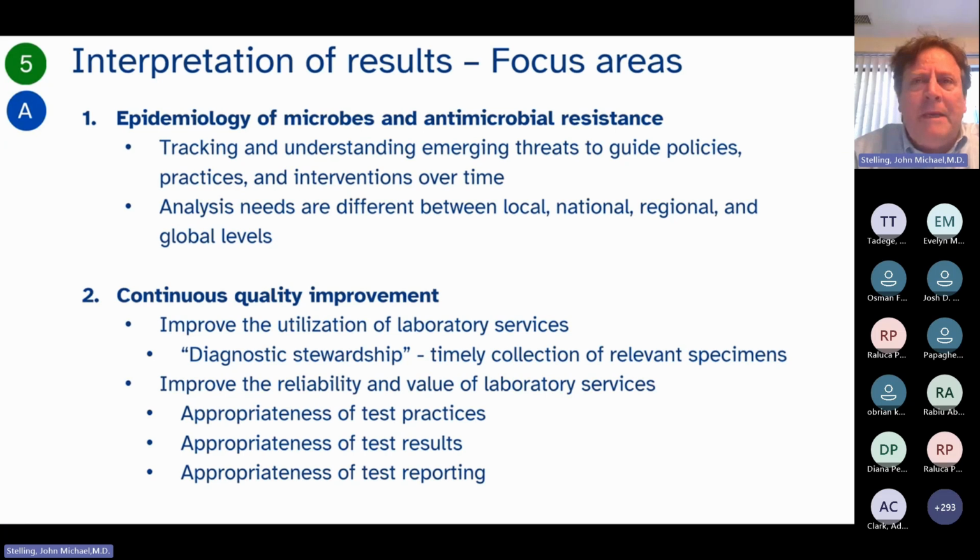For example, many laboratories take a lot of samples from wound and sputum and urine, in part because it's important, but in part because they're easy to do. But a lot of laboratories do not do many blood cultures or cerebrospinal fluid cultures. They're more challenging. But for patients with certain diseases, the blood cultures can be life-saving to diagnose sepsis, which organism, which resistance, to confirm meningitis. So diagnostic stewardship, are they doing a lot of blood cultures or very few blood cultures?